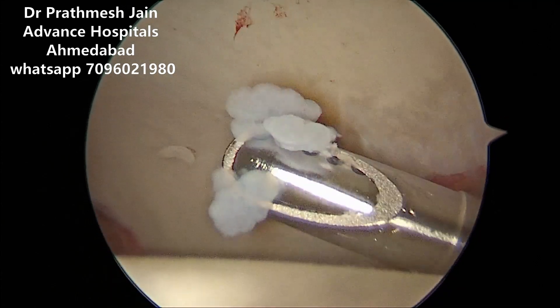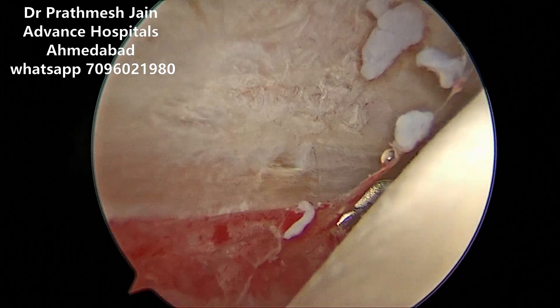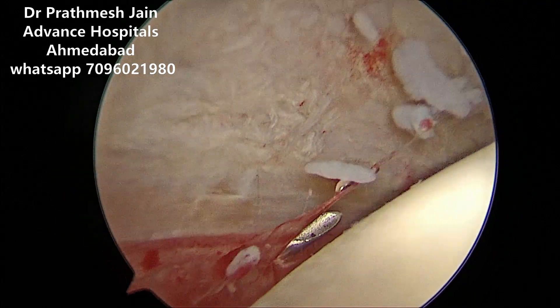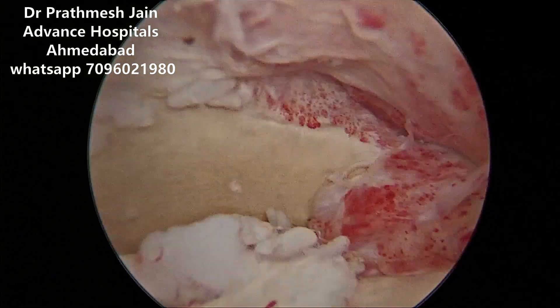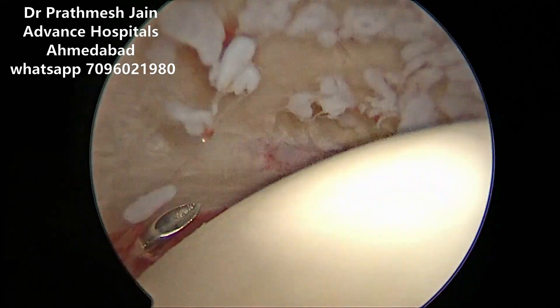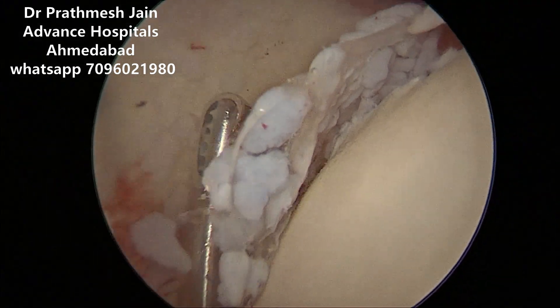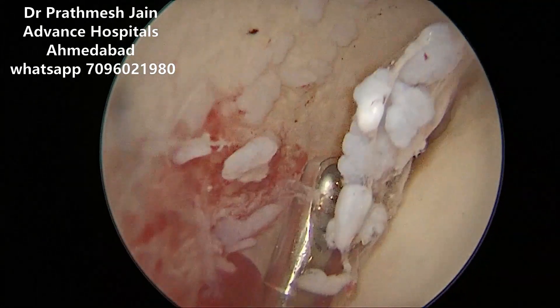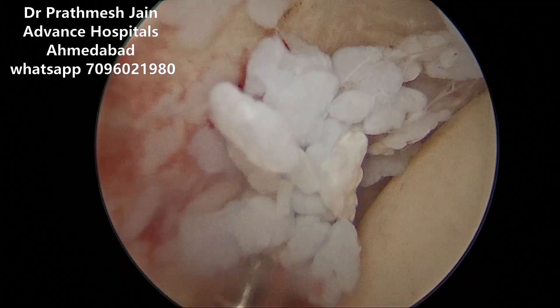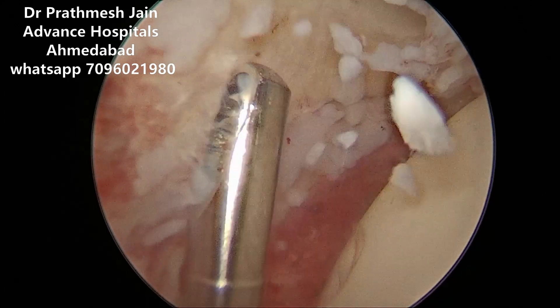Here we are using a curved shaver blade for this particular purpose. It is very imperative that you use this because you need to reach the center of the compartment. We are making a posterolateral portal very carefully, keeping in mind the sciatic nerve. Using a cannulated spinal needle and the posterolateral portal, we can remove all those fragments of synovial chondromatosis lying in the center near the acetabular cartilage. You can see the inflamed capsule on the posterolateral compartment as well. A curved shaver blade is very important here to clean all the synovial chondromatosis tissue.